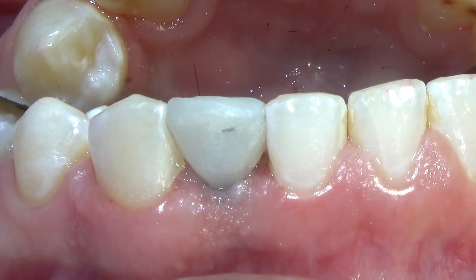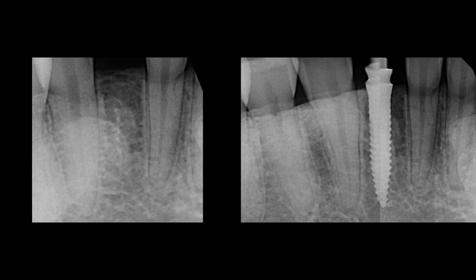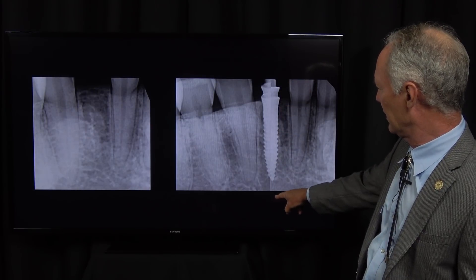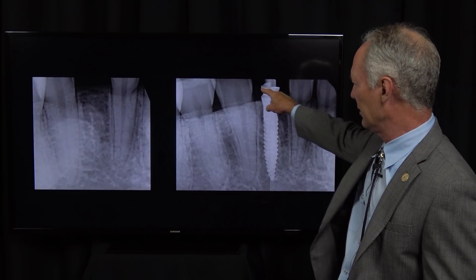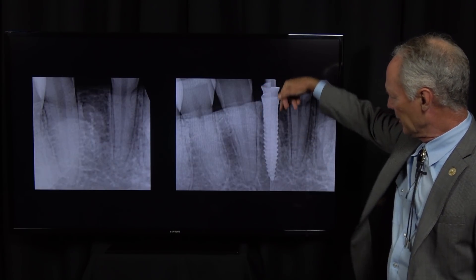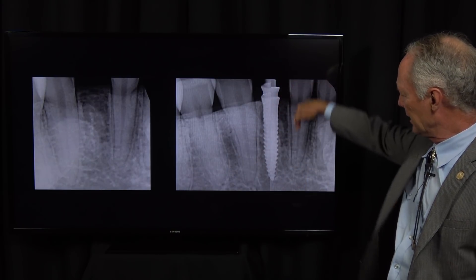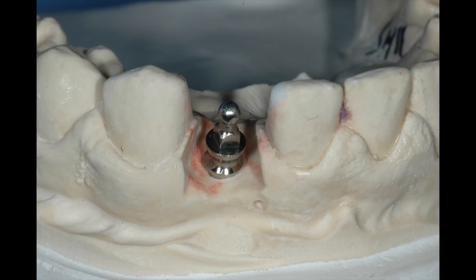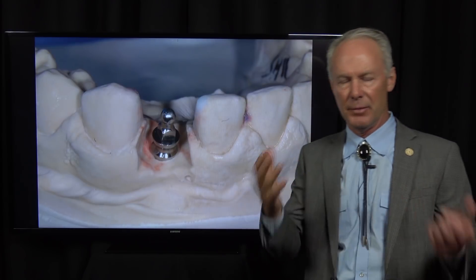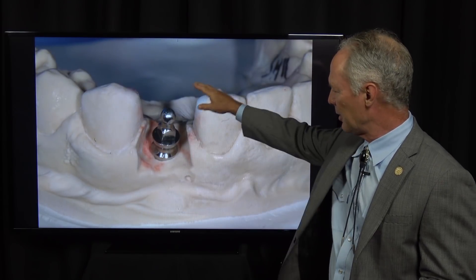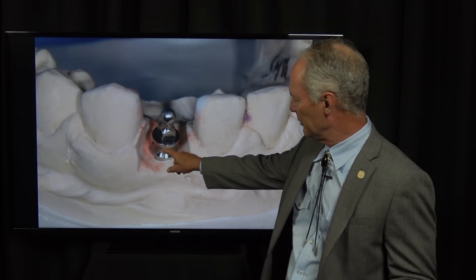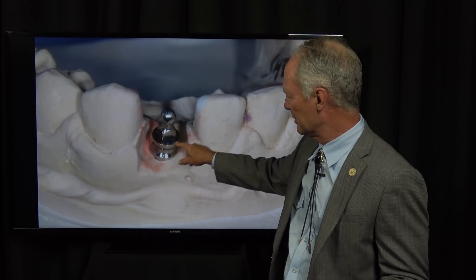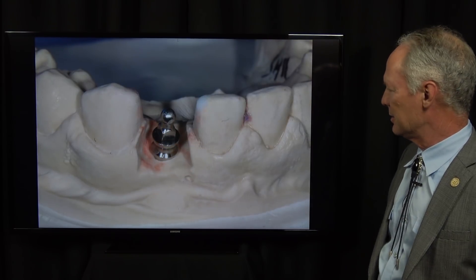Then I check the occlusion — I don't want it contacting at all. There's the provisional in place and the seated implant. You can see all the threads are under the bone and this shelf is just a little bit subgingival. Take your time because you don't want to screw that into one of the adjacent teeth. With this small diameter implant you don't need a separate abutment — the coronal part of the implant is the abutment. The crown seats to this shelf, and this part is in the soft tissue.